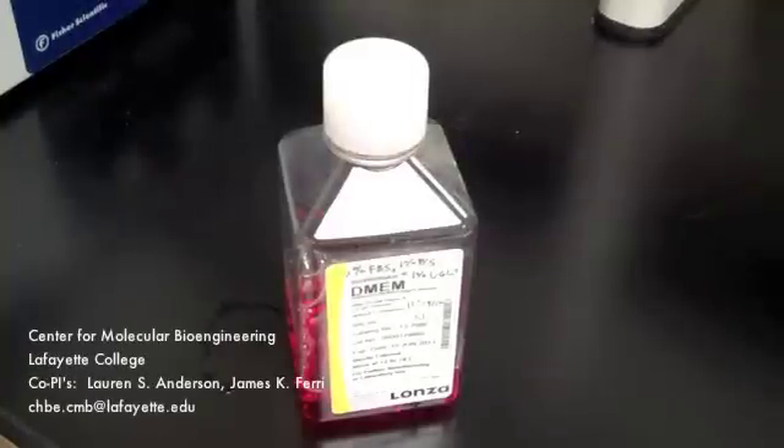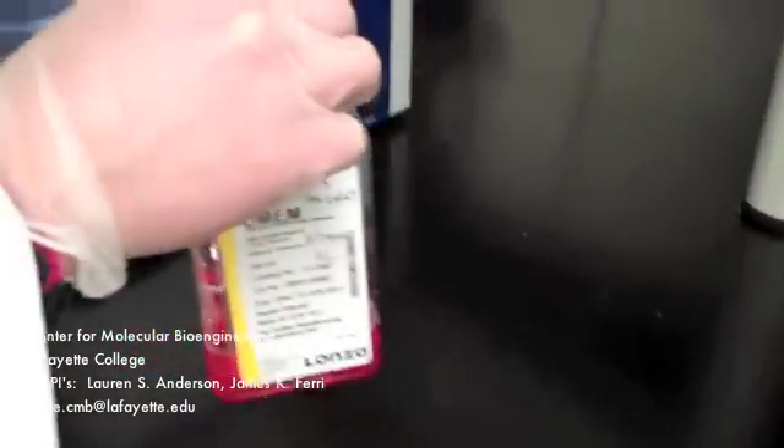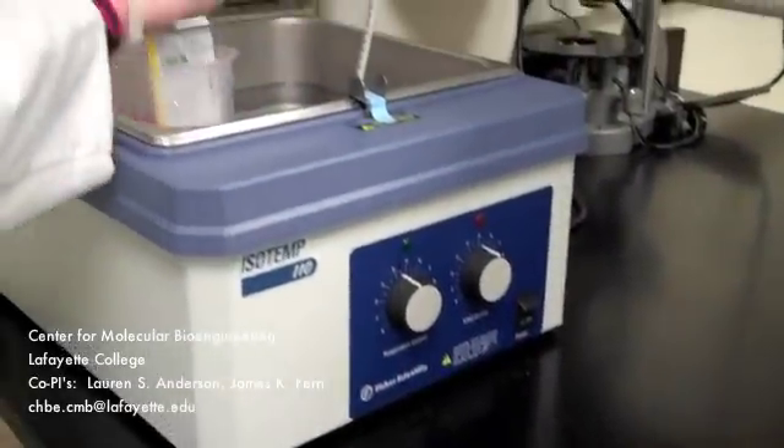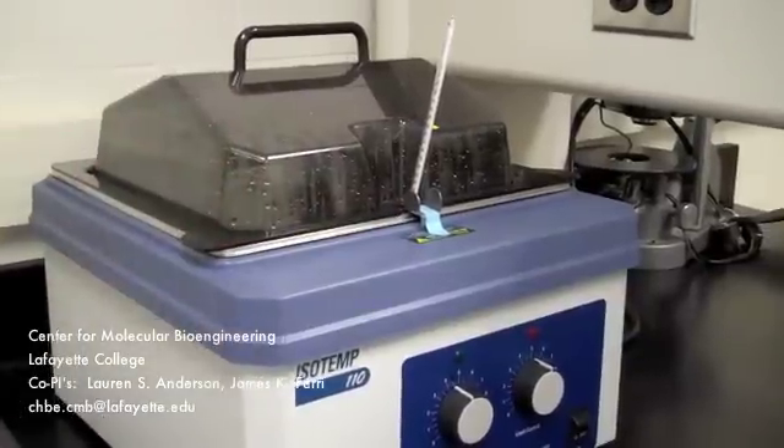To change the media in a T75 flask, begin by placing the appropriate media in the warm water bath to raise the temperature of the media. The water bath should be at 37 degrees Celsius. This should take about 5 to 10 minutes.